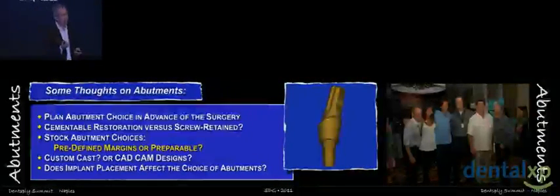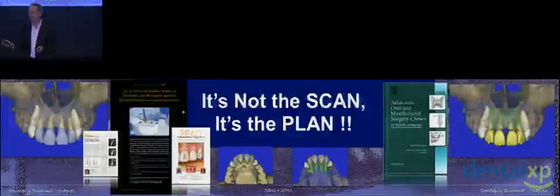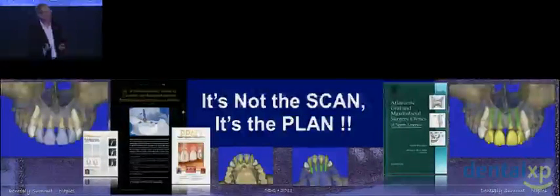And does the implant placement affect the choice of abutments? Of course it does. So we need to link all of those solutions together in advance of being able to treat the patient. And as was already mentioned, my slogan, of course, is it's not the scan, it's what you do with it. It's how you create that plan.